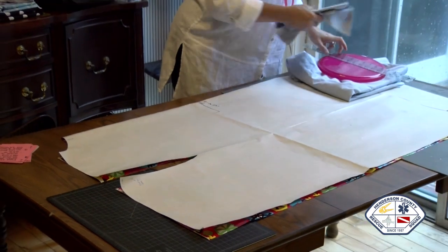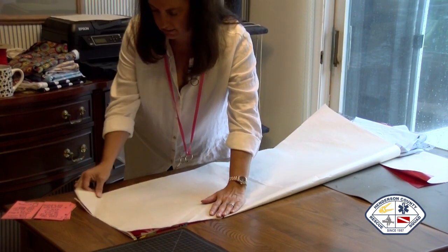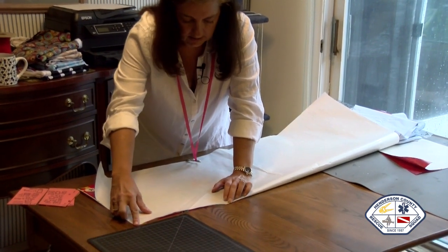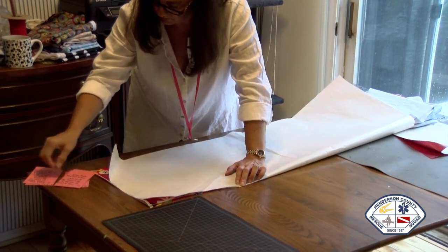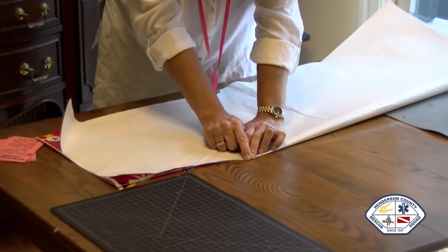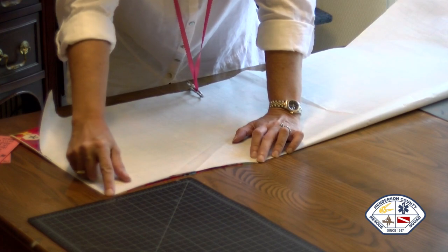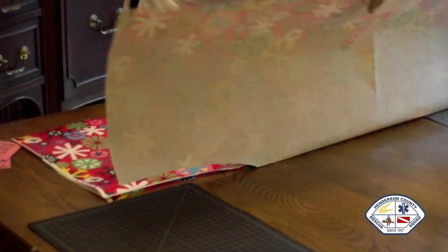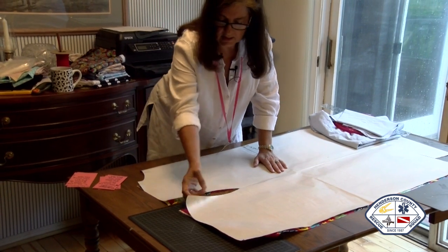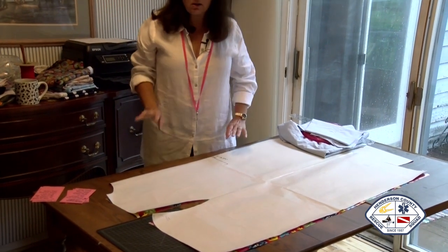Now, what we're going to do next is fold half of our pattern over, sides to sides, covering up your neck piece, and you're going to cut an inch out, or mark an inch out. And 11 inches down to this mark, but you're not cutting out there. That's just where you end. You're making an armhole, and you're going to angle it up in a curve to that 1 inch mark. When you open it up, you have a neck hole for the center, and ultimately you have 2 armholes right there. So that's all the real marking you have to do.